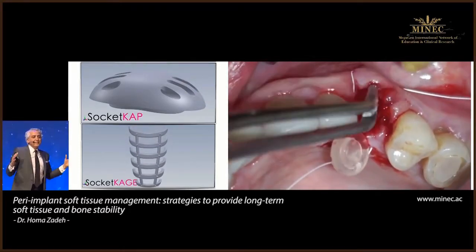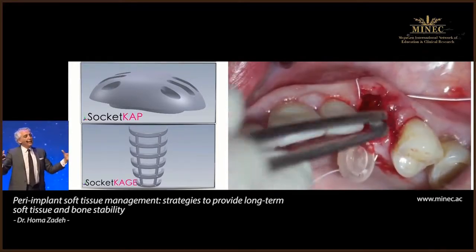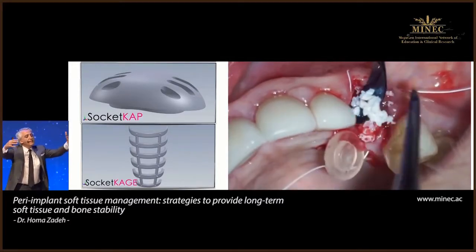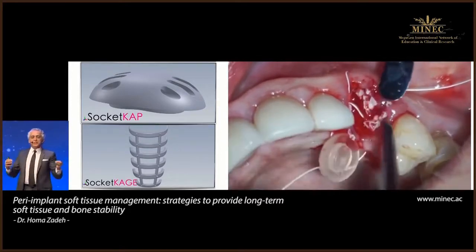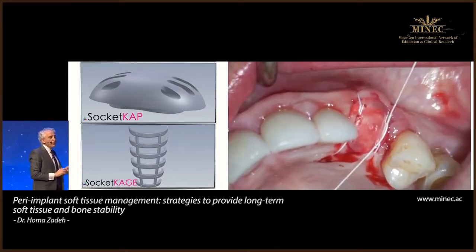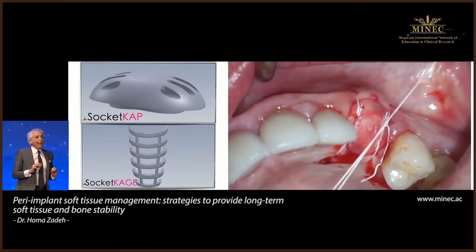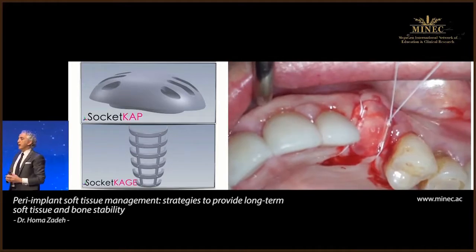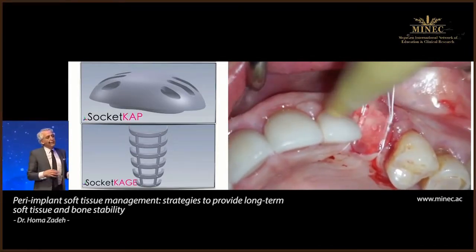Then this is the cage. Because there's a buccal dehiscence, I put this device that's very rigid and resorbable in the socket to keep that contour and prevent it from collapsing. Then the particulate graft, which is a xenograft, is placed, and the socket is closed. So this is a very, very minimally invasive procedure. We allowed the area to heal. Could we have placed the implant as Dr. Han showed earlier? Yes, that would have been also possible.